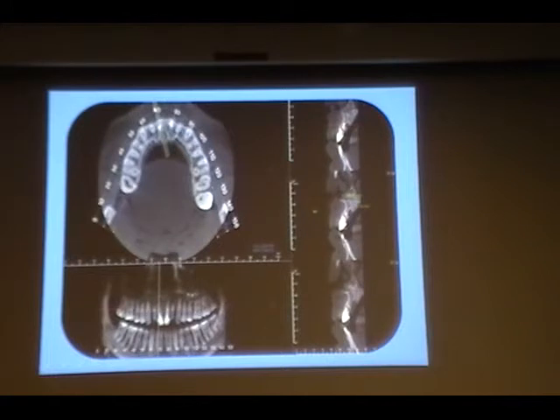Each line will represent one slice here, a smaller portion, and then the second one you can see, and then there is a third portion. So the numbers, you can use these numbers as your guide. So you're 70.18, 71.18. So we made here 1 millimeter slice thickness.